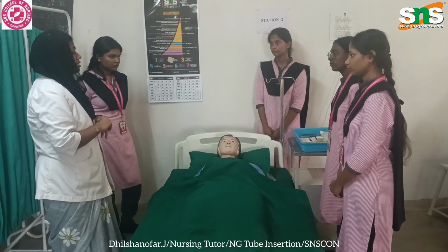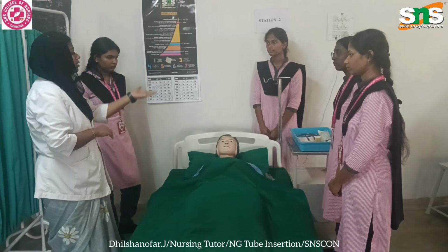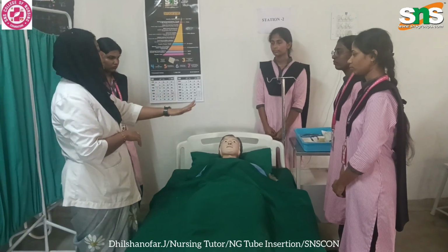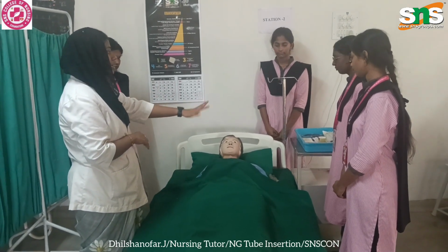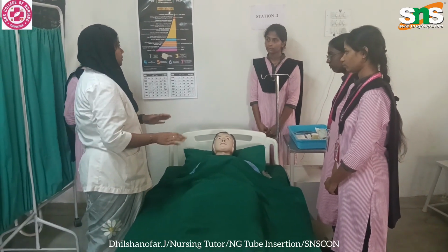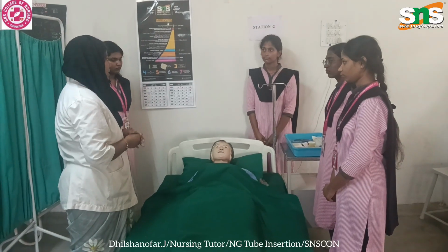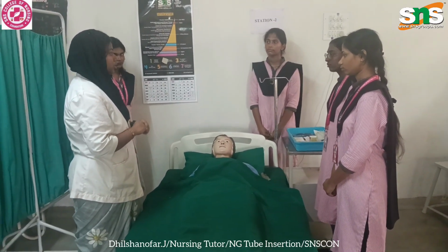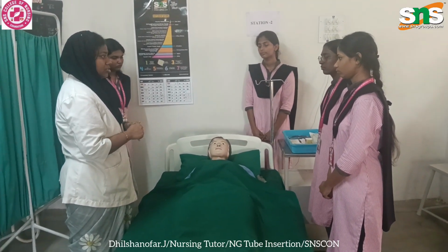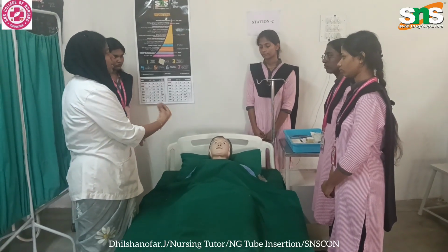Whatever articles we listed should be present near the bedside. Then the next thing is you have to position the patient. If the patient is in an unconscious state immediately after surgery, we can place the patient in a supine position, then we can administer.